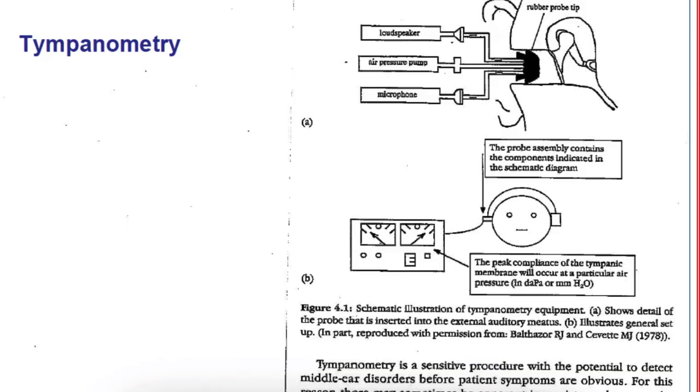Okay, so these are the history taking of the ear and physical examination and hearing tests. Always we have to correlate history with tuning fork tests. These tests will give a diagnosis in most cases without any expensive investigations.